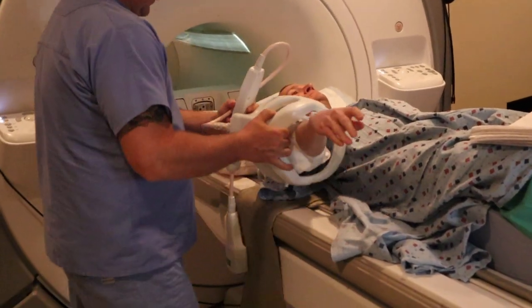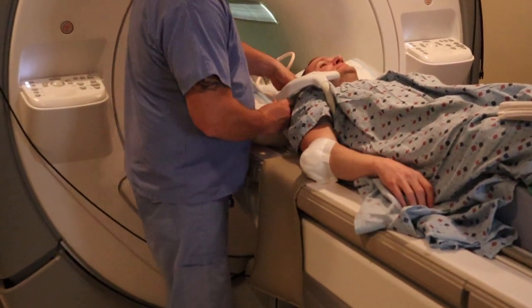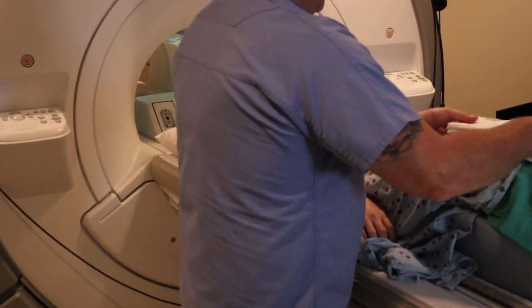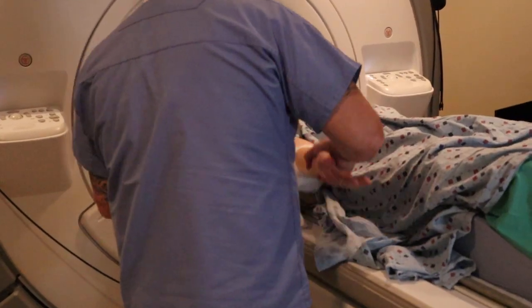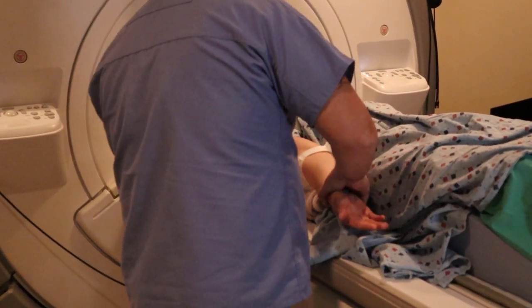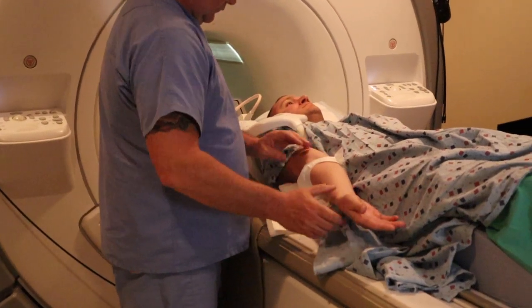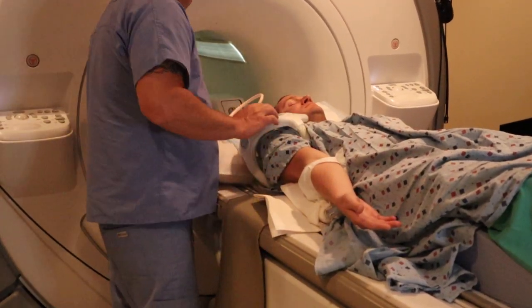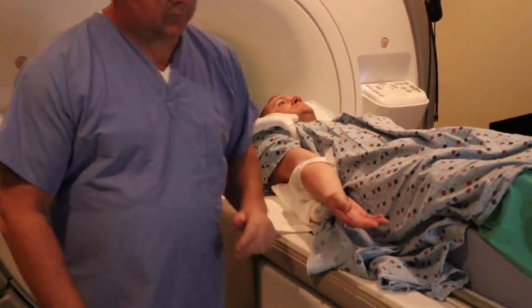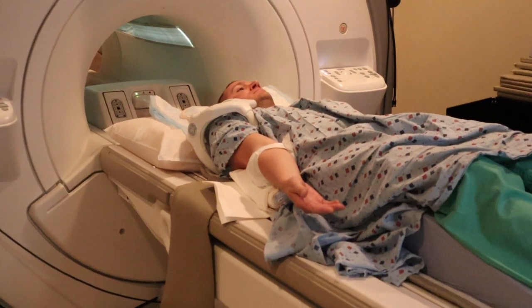You're going to ensure that the arm goes through the coil and up around the shoulder. This is a very versatile coil — you could also use it for an elbow that's injured and can't be straight. For shoulder positioning, you want the palmar side up, in external rotation. That opens up the shoulder joint. You want the arm in plane.